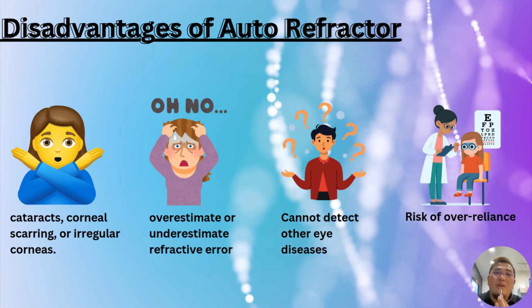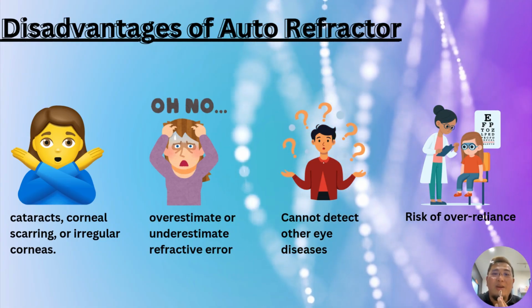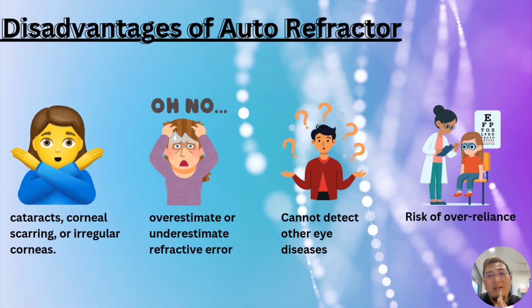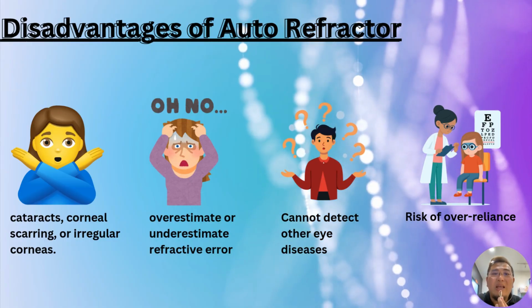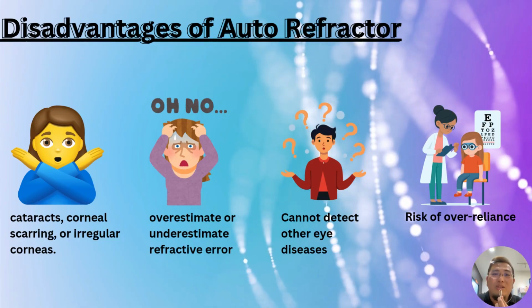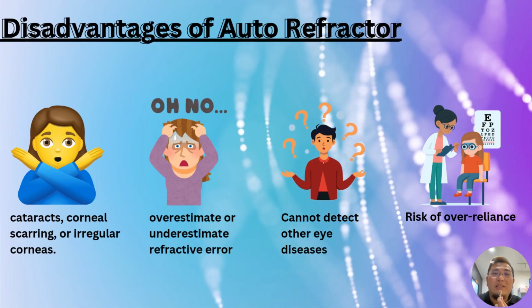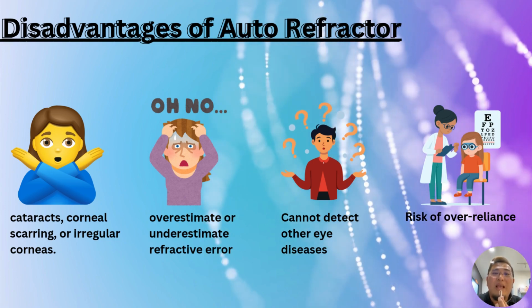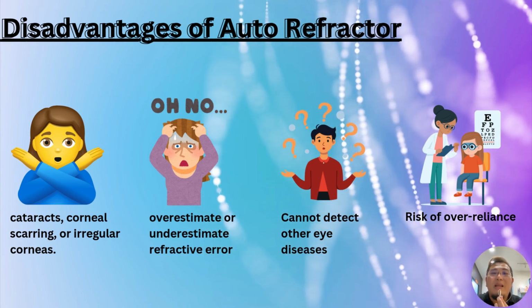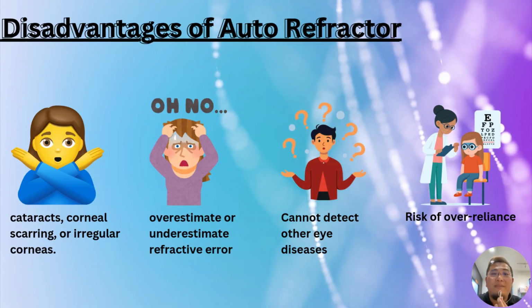The autorefractor is a valuable time-saving tool that improves efficiency in eye care. But like all technology, it has its limits. It should always be used in combination with professional clinical judgment and other diagnostic methods for comprehensive eye care. Next, we go through the steps for how to use an autorefractor that I have in my practice.